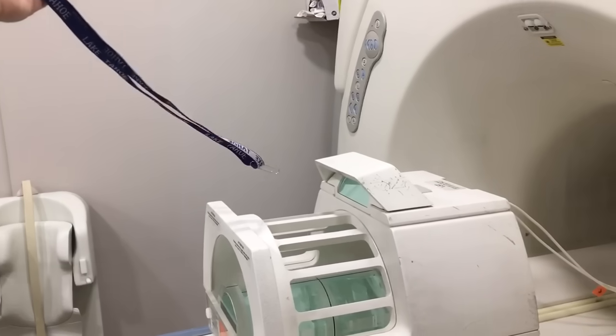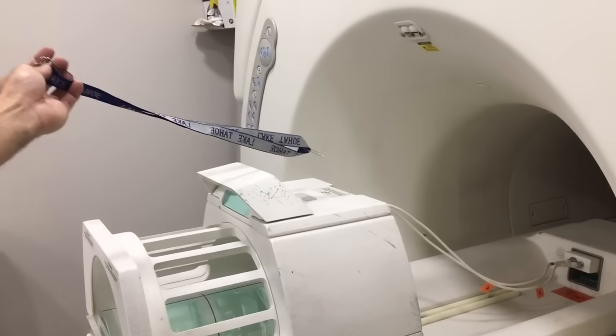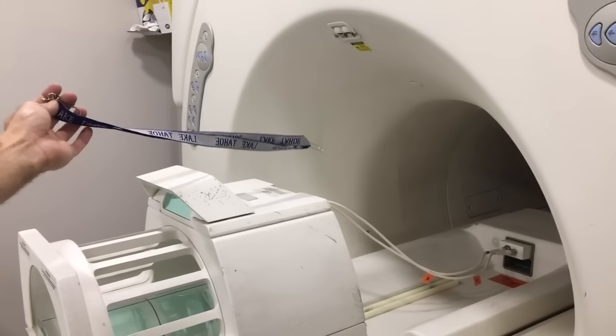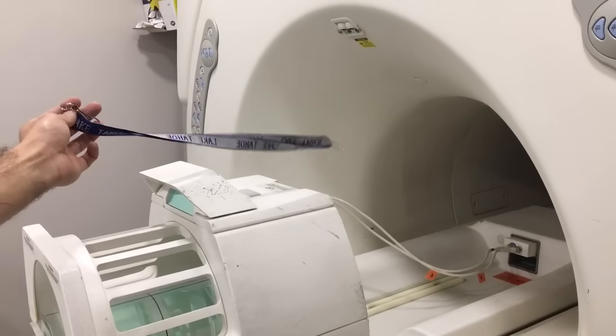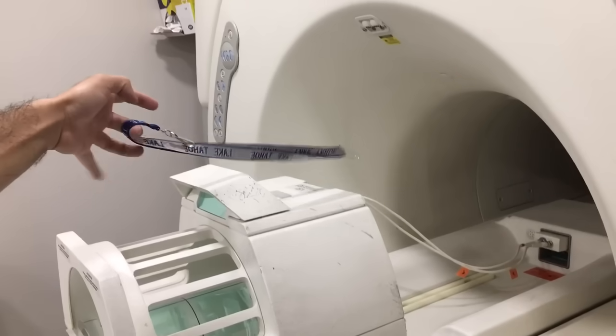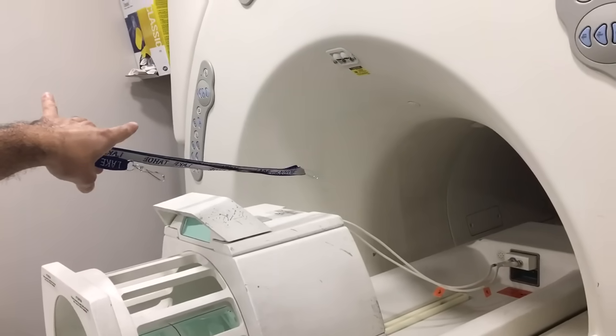We're getting three feet from the magnet, two feet from the magnet, and that's pretty much as strong as it's going to get right at the edge of the bore there. Now this is just a paper clip, but as you can see, the end of the lanyard is also still being pulled.